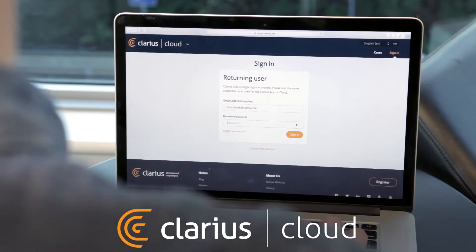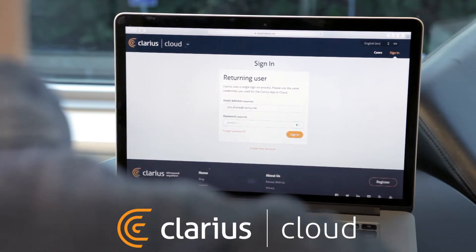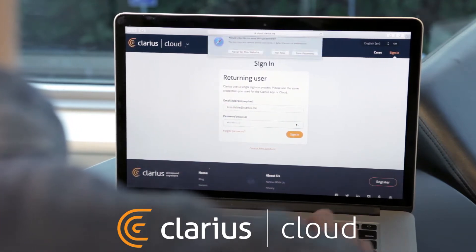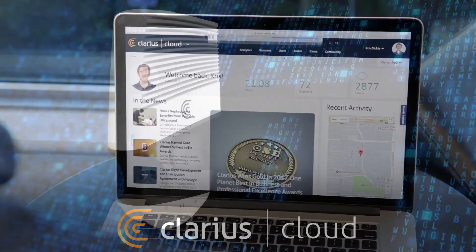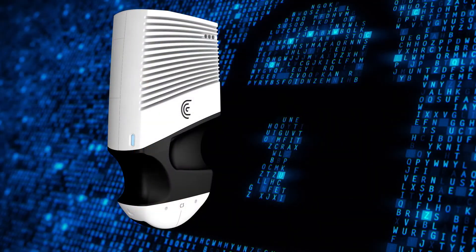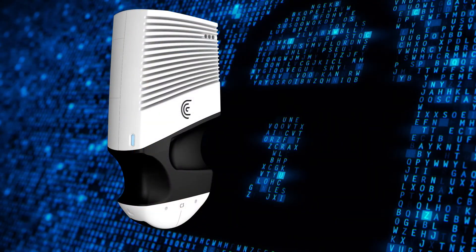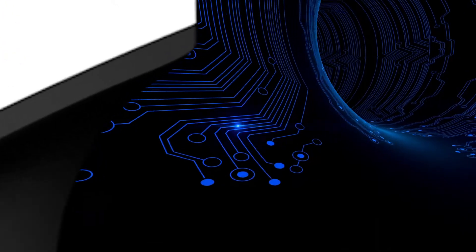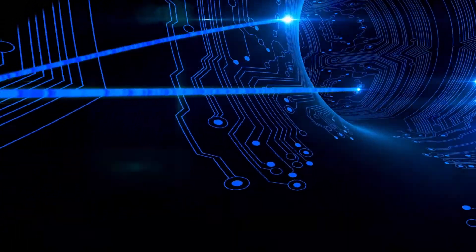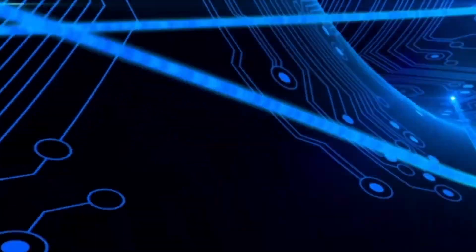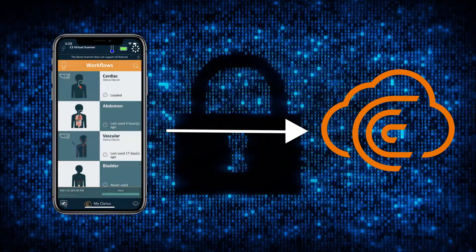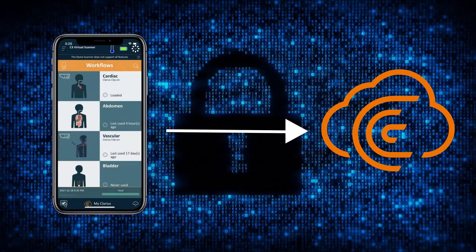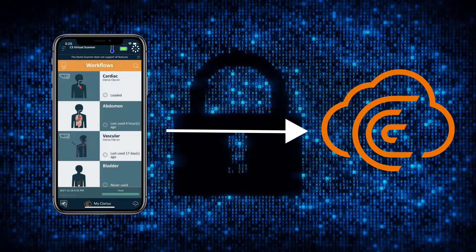Your ultrasound data is sent directly from your smart device to the Clarius Cloud. While you're using a Clarius scanner, exam data and patient information are first stored on your smart device. Exams are uploaded to Clarius Cloud over encrypted HTTPS when an internet connection is available.